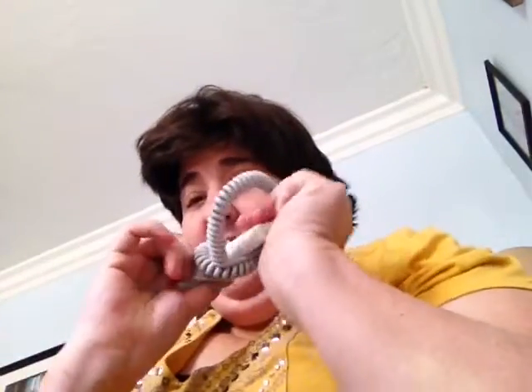That's the box. My other box, I don't know, the boxes feel identical, but the thing was smaller. And I'll show you the way it's insulated. But I think this one, they want you to take this off every time because the way it's in here, there's no room for the wire to come out. Sorry, it's awkward. So what I'm just going to do is put this back in, and then I'm going to put the user guide under, because I always keep the user guides with it even though I don't need them. Then I'm just going to loosely wrap this and just stick it. And so it just fits in.